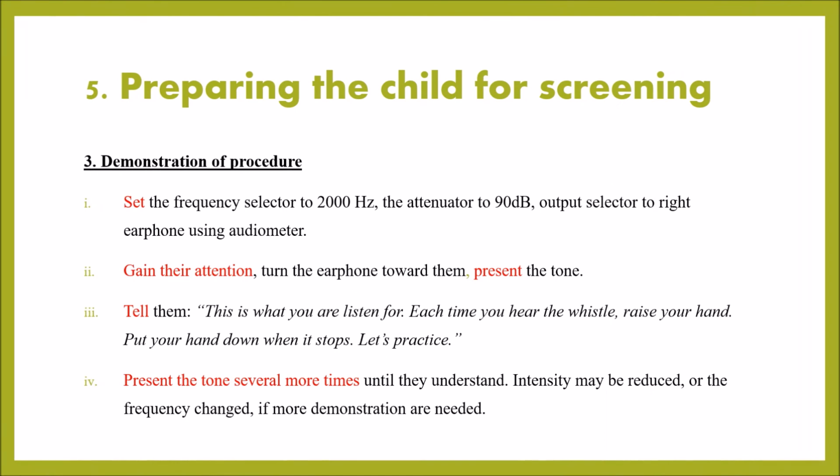The third way of preparing the child for screening is by demonstration of procedure. Instead of giving them instruction, the tester can demonstrate how to perform the screening to the children.